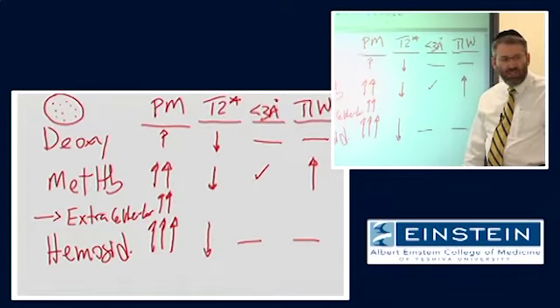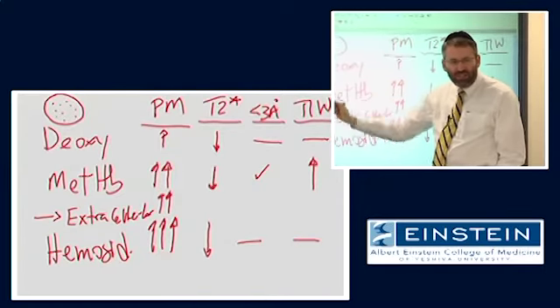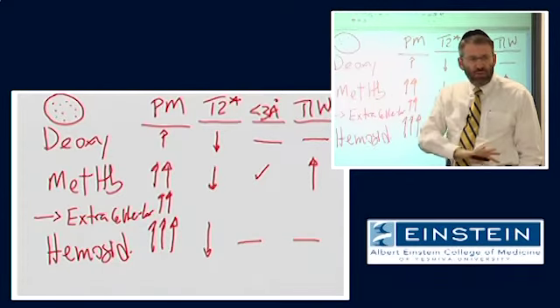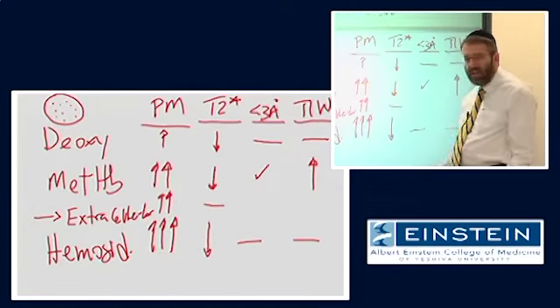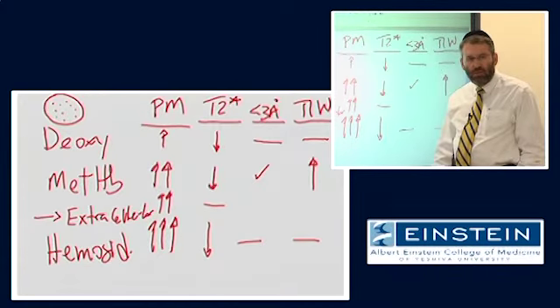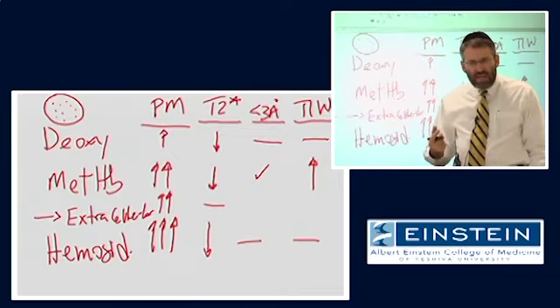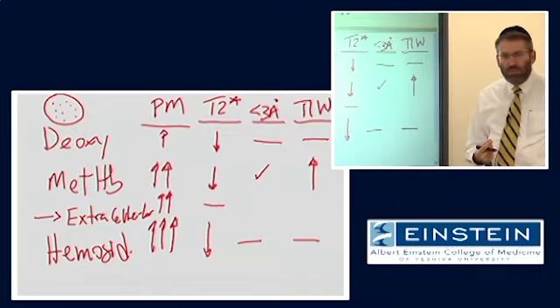But it does have an impact on the signal that we see in our image, because now we don't have those gradients of magnetic susceptibility. This paramagnetic stuff is now at an even concentration throughout the clot. And we lose that signal loss due to T2 star mechanisms. So this really just drives home the point that I tried to make earlier, that it's not the absolute magnetic susceptibility. It's the gradient of magnetic susceptibility.